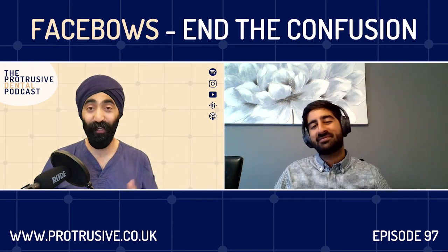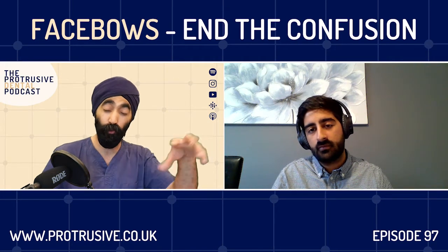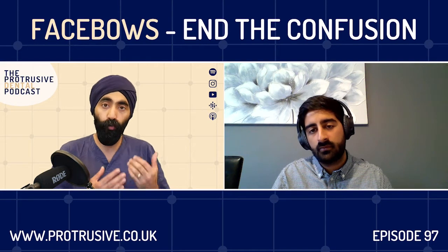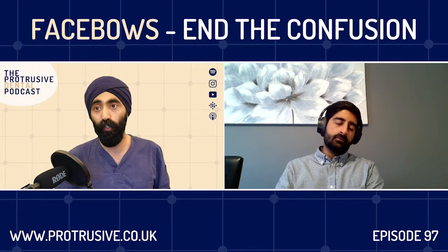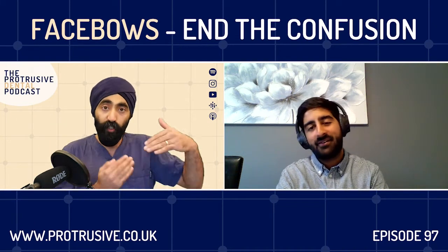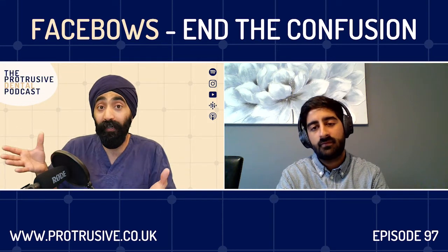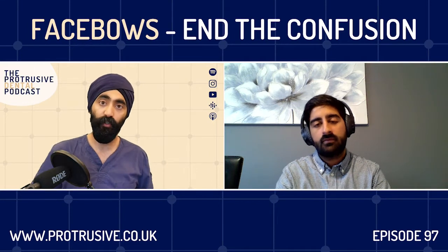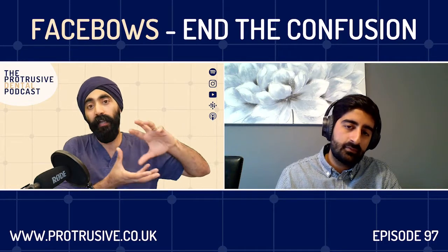And I'm grateful that you shared that with us. And just on that point about multiple restorations, I used to think multiple restorations equals Facebow and you should do it. It makes sense, but you're completely right. In that scenario, when someone is already canine guided and they get near immediate disclusion already, then even if you're doing the 4, 5 and the 6, you may not need it so much because you already have that disclusion in there. Yeah. But if you're conforming to group function and you want the anatomy of the teeth to exist and not just be flat, you're completely right, because now the technician is able to dial it in and build it up in a way.